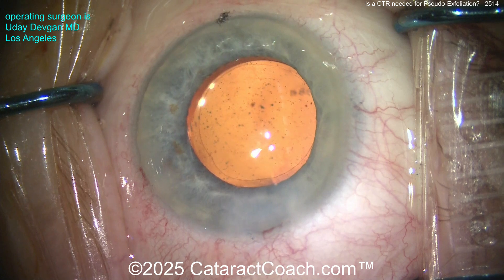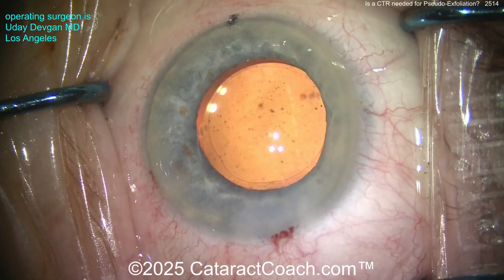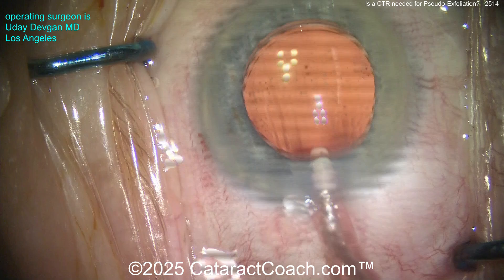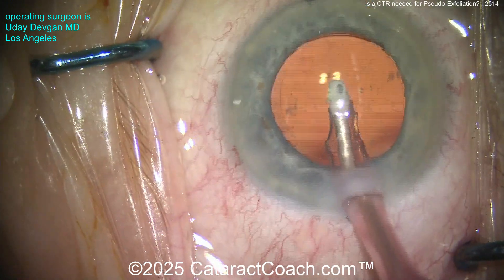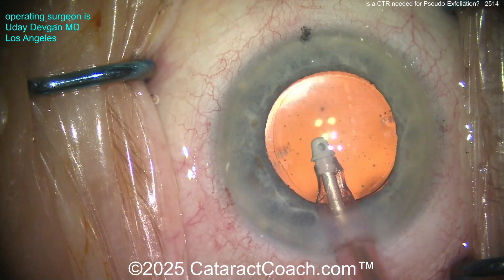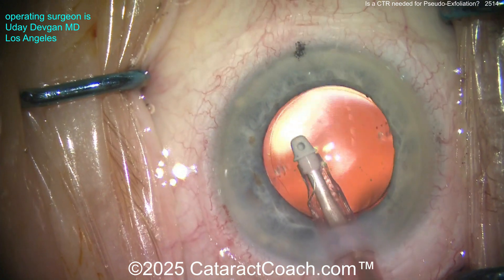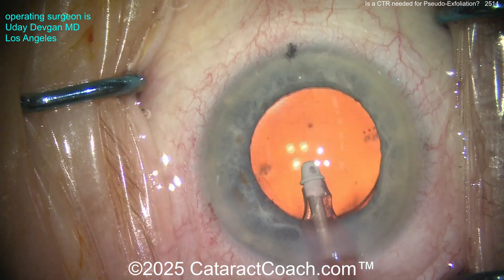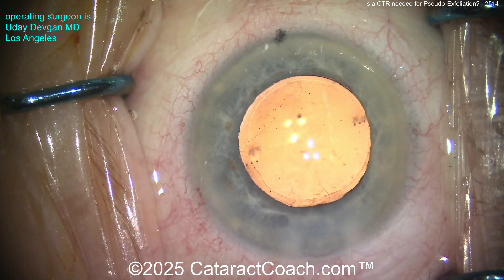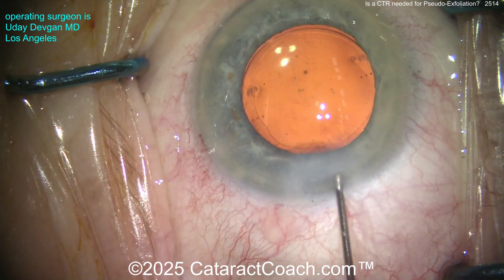At the end, let's hydrate and seal the main incision. We can do some final IOL positioning if needed. A little bit of air bubbles — no big deal, those will resolve on their own. Going in to the side port to adjust the final IOL position. Using the IA probe to remove any remaining viscoelastic and get out those small air bubbles. The toric lens is pretty much on target — maybe a little fine adjustment at the very end.